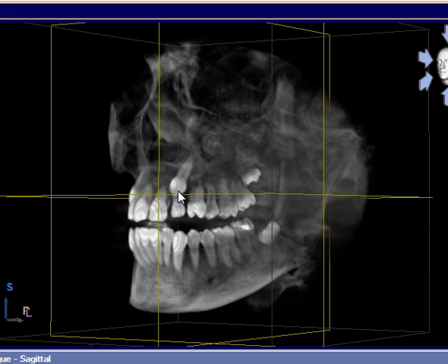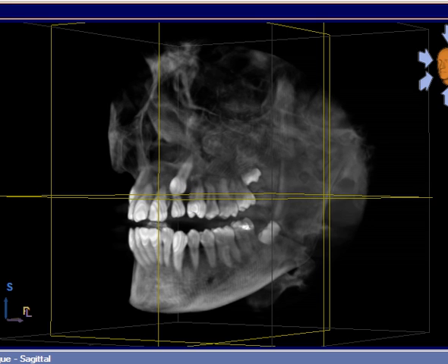As a matter of fact, it's sort of eaten away the root of this tooth, really compromising the long-term health of this tooth. This canine tooth actually belongs right here.